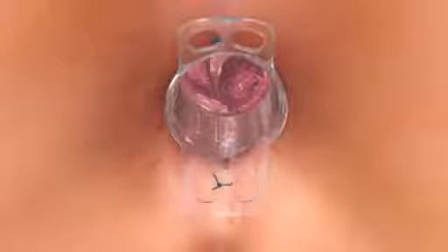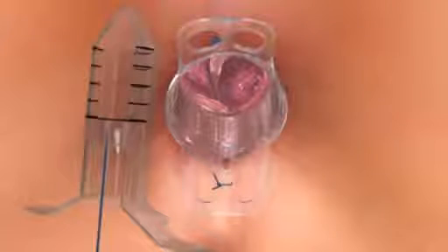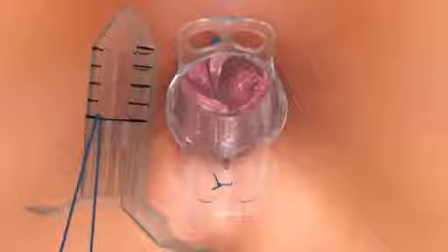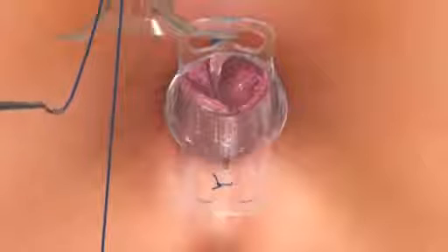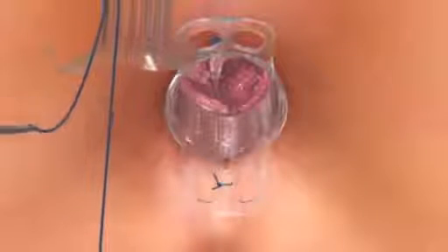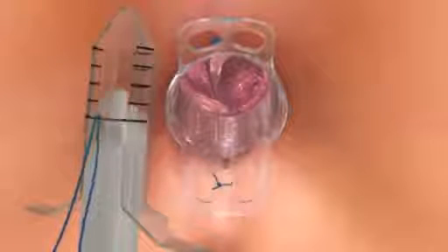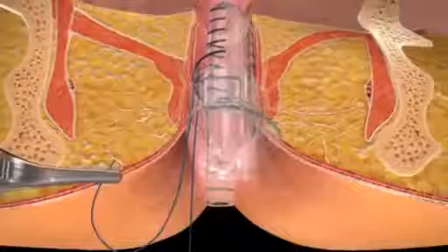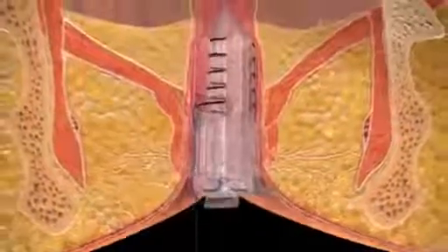Secure the port to the buttocks with stay sutures. Thread the loose end of the purse-string suture through the open end of the anuscope, under the transparent bridge, and back over the outside of the bridge towards the opening. Attach a clamp to the loose end of the suture and place the loose end of the purse-string behind one of the anuscope handles and out of the way. Insert the dilator into the anuscope with the pre-threaded suture. Reinsert the nested dilator and anuscope and remove the dilator. The dilated anal canal and transparent anuscope enables the dentate line and underlying anatomy to be visualized.